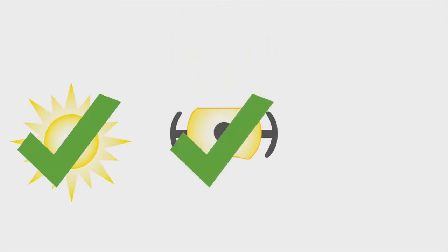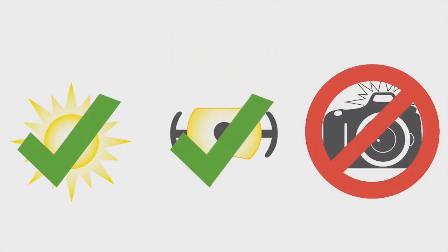Next, make sure the teeth are well lit. Sunlight is ideal. If that's not an option, use the overhead light in your operatory. Don't use your camera's built-in flash because it generally creates more problems than it solves.